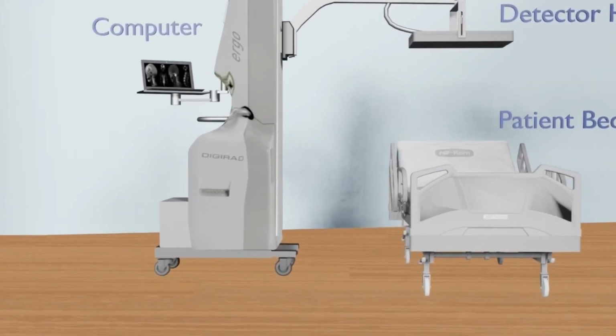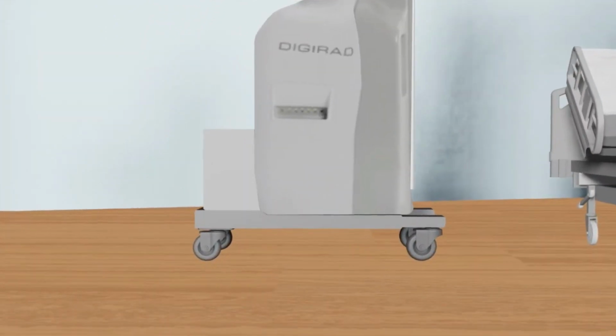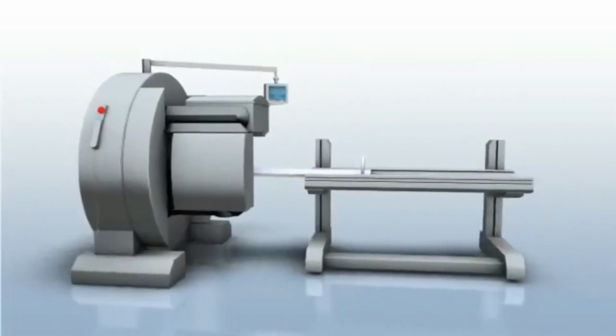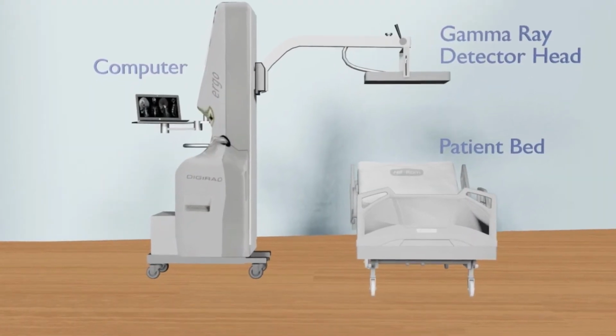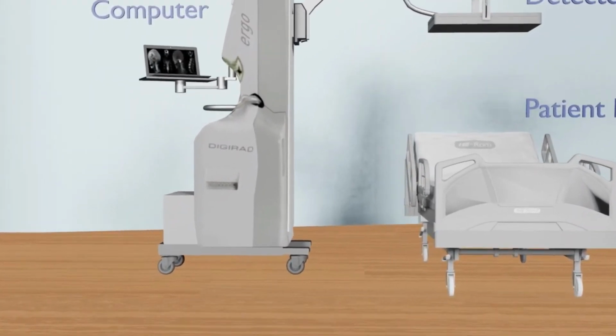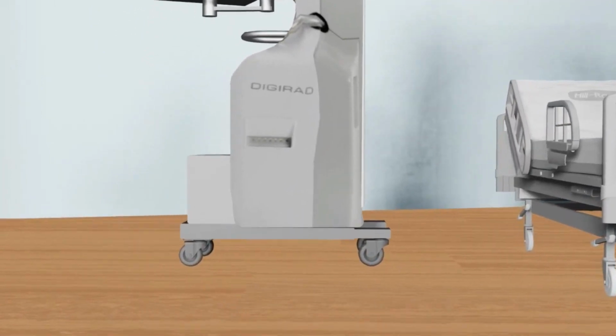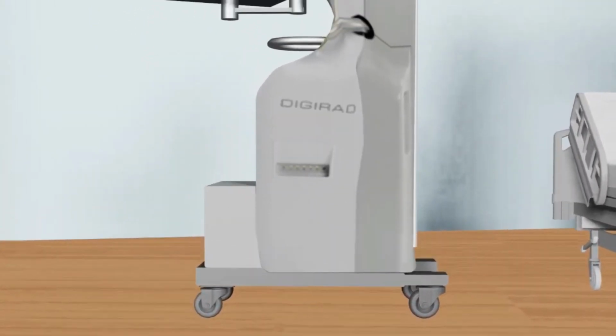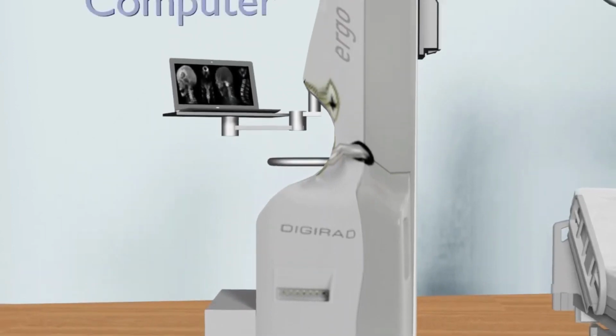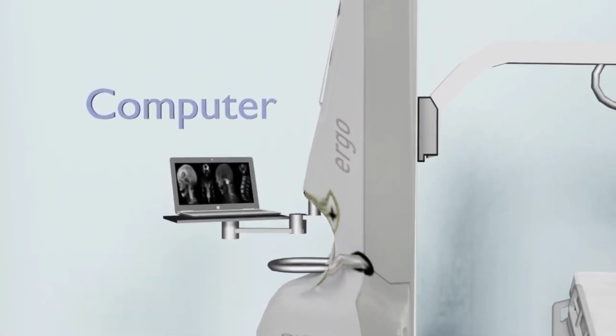Let's look into types of gamma cameras. There are two types of gamma cameras available currently on the market: the mobile gamma camera and the fixed gamma camera. Let's first look at the mobile gamma camera. The mobile gamma camera is a fully portable and mobile unit. It is an imaging technique to generate functional scans of organs in the body such as brain, cardiac, neurological, and kidney, as well as scan small organs including the breast, thyroid, pancreas, and others.